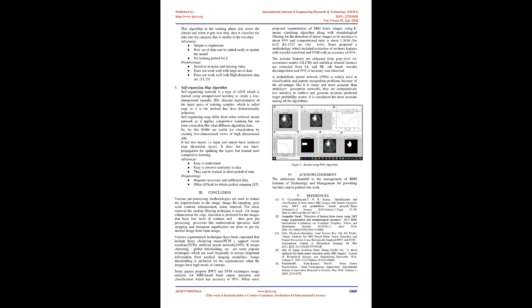Fuzzy C-means is one of the best and most widely used fuzzy clustering algorithms. Advantage: gives good results for overlapped datasets. Efficiency is better than the K-means algorithm. Disadvantage: takes more time because of more iterations involved. Euclidean distance measures can unequally weight the factors. 2. SVM algorithm.